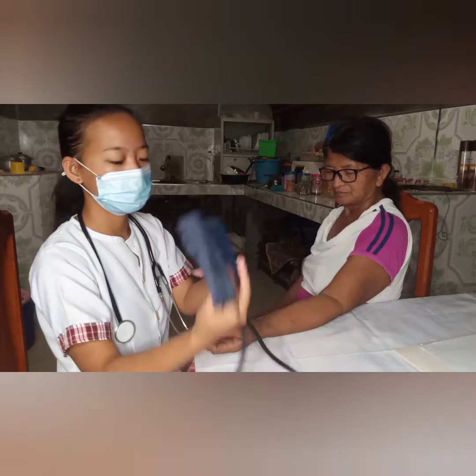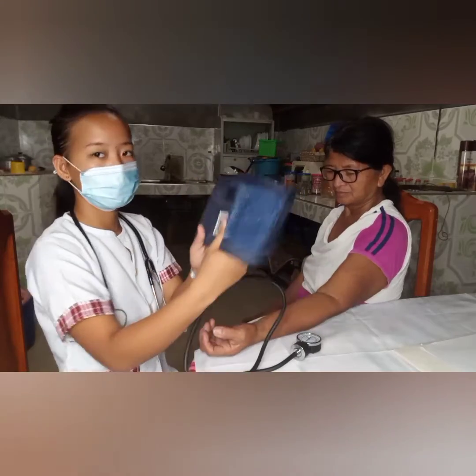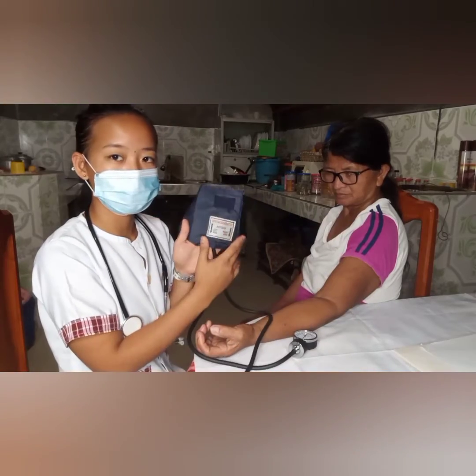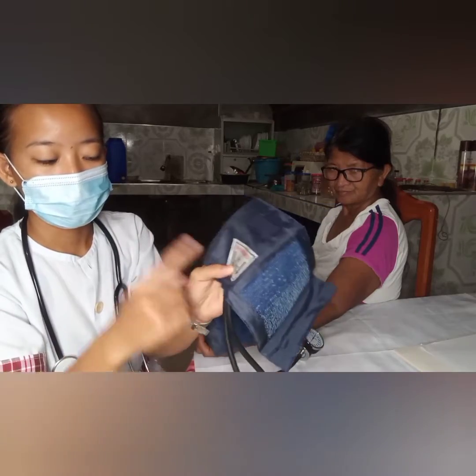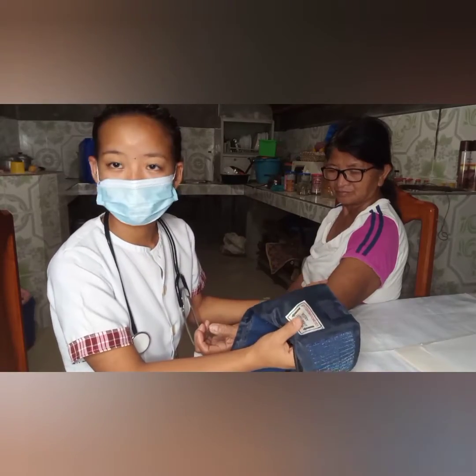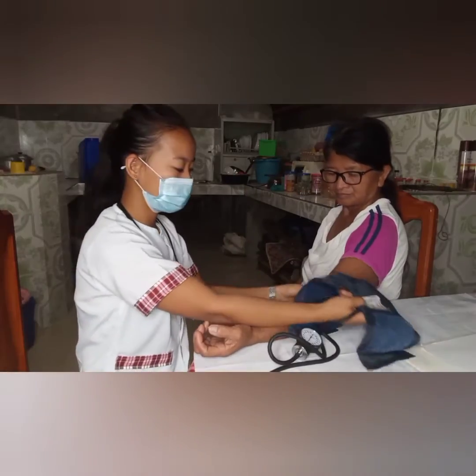And here we have the blood pressure paraphernalia, which we will be putting over the arm of the patient, like that. Note that we have here the basis, which will help us identify where to align or position this. Since we are using the left arm of the patient, we are going to locate this part, which is the left arm, on this part of the patient.